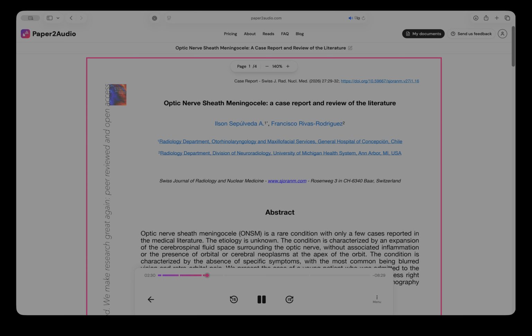Figure 1 summary. The figure shows CT images of the head. The images depict a well-defined intraconal cystic mass. The mass does not show bone compromise, but does show displacement of the extraocular muscles. The mass is hypodense and homogeneous. There is no enhancement after intravenous contrast injection.